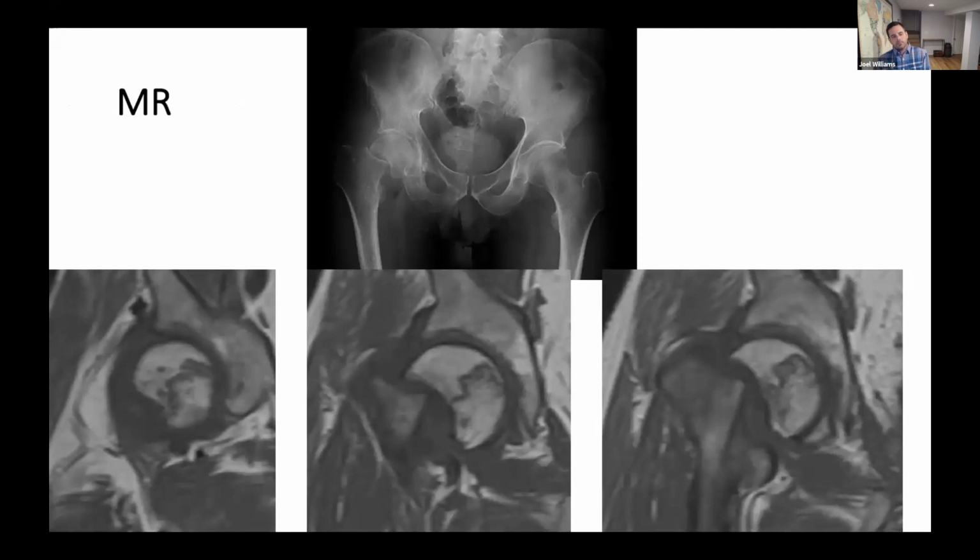I think I've got a preoperative MRI in one situation. This was the patient. He presented about 3 weeks after this fracture. It's sort of a long-winded story, but in any case, he didn't show up at the hospital till 3 weeks after the event. So I was quite concerned about the viability of the head, and you can see some coronal images at the bottom that showed the weight-bearing dome of the femoral head looks largely unaffected, but the inferior portion is questionable.